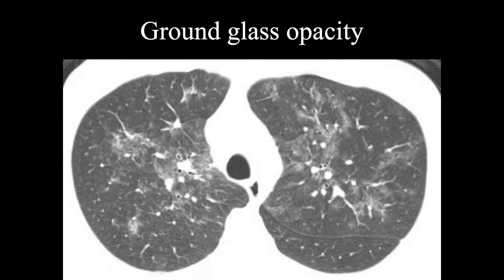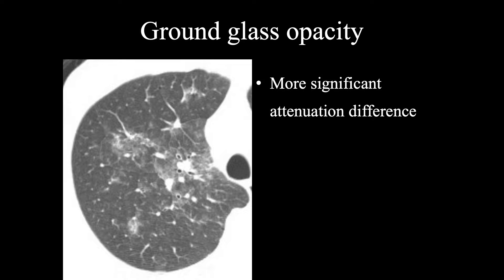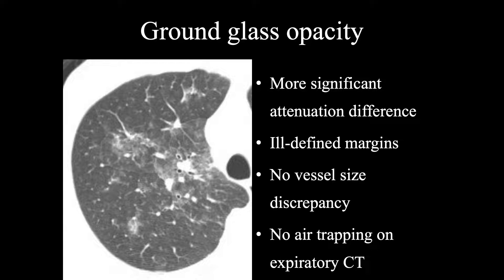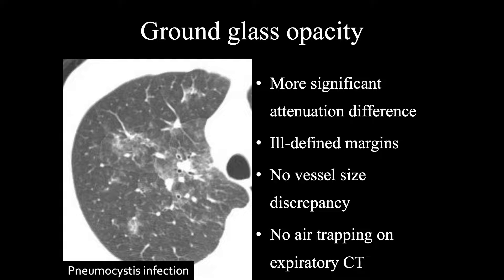This is an example of ground glass opacity, demonstrating the opposite findings. There's usually a fairly significant difference in attenuation between the abnormally opaque lung and the more normal, more lucent lung. The margins at the edges tend to be ill-defined. The vessels are not bigger or smaller in any area of lung, and if the patient has expiratory CTs, there should be no air trapping in any lung regions. This is an example of pneumocystis infection.